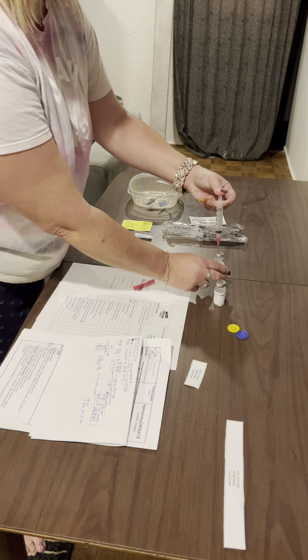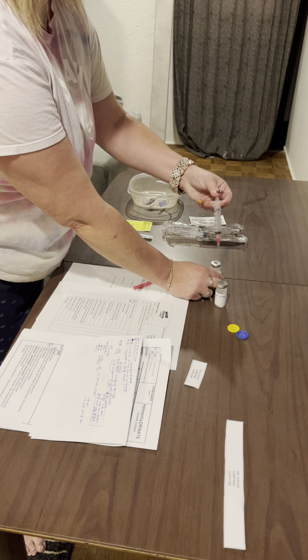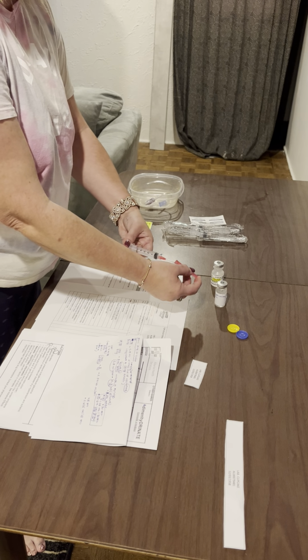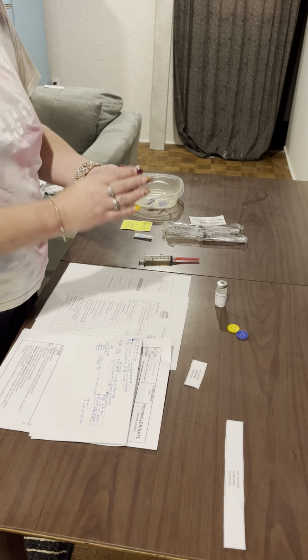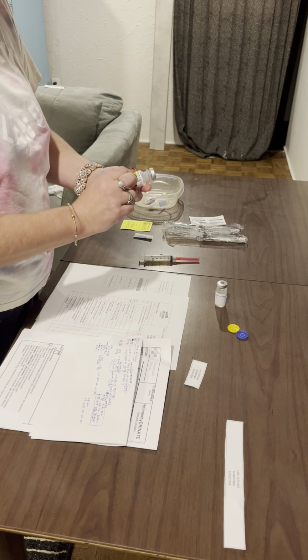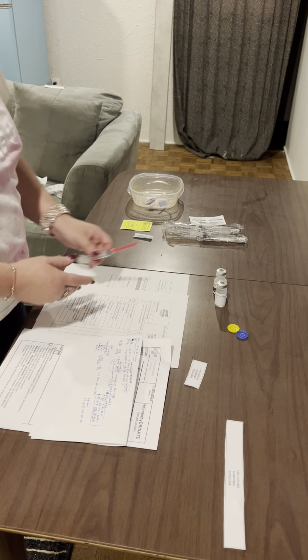Okay, great. After we've done that, we can take it out. Okay, we're going to recap. Great. So we've done that, and again, just because I like to double check, that was the normal saline that we took the 4.5 mils of air out of. So again, normal saline. That was great.